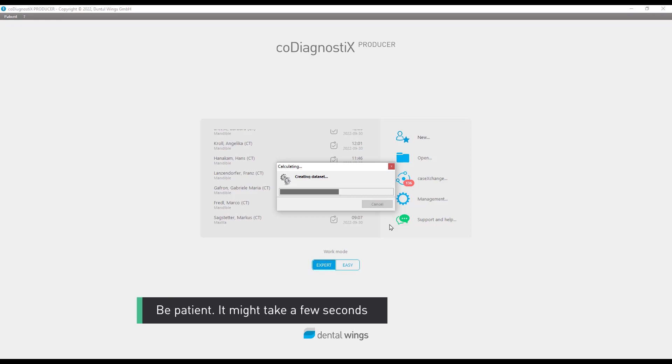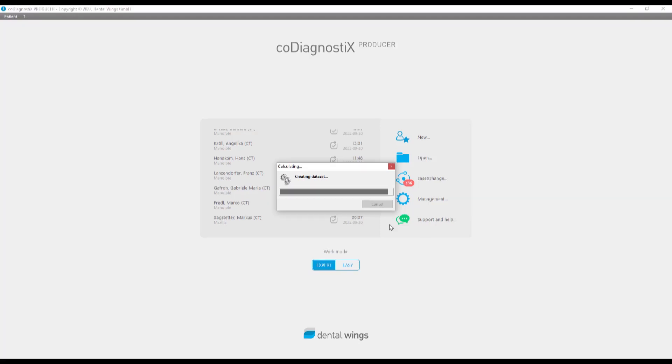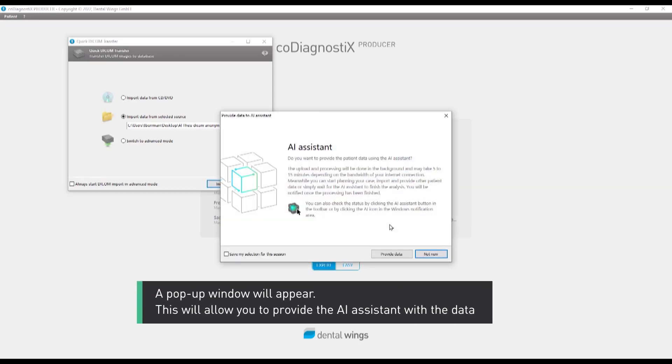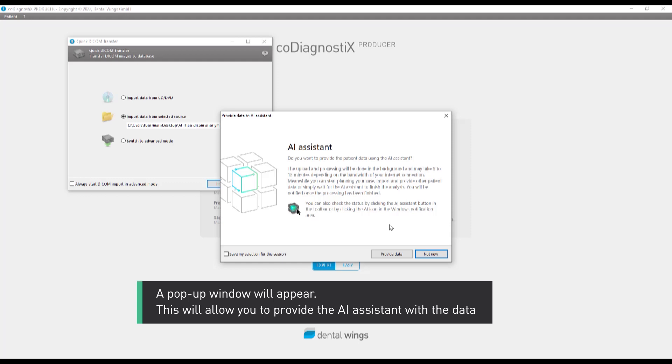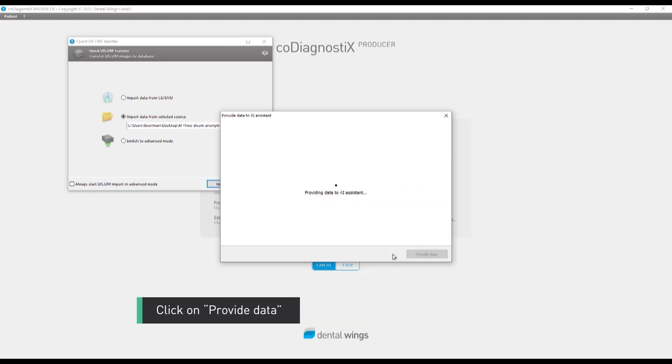Be patient. It might take a few seconds. A pop-up window will appear. This will allow you to provide the AI assistant with the data. Click on Provide data.